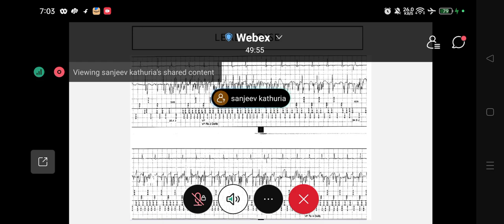They're almost the same, sir. They are of the same patient. There were 2 strips, so I cut it and put it like this. Anyway, let me explain it very easily. See the second step. Just keep seeing my arrow. There is a ventricular sensing. That means the ventricle is saying, okay, there is a rhythm which is coming, but the rate is not that high.